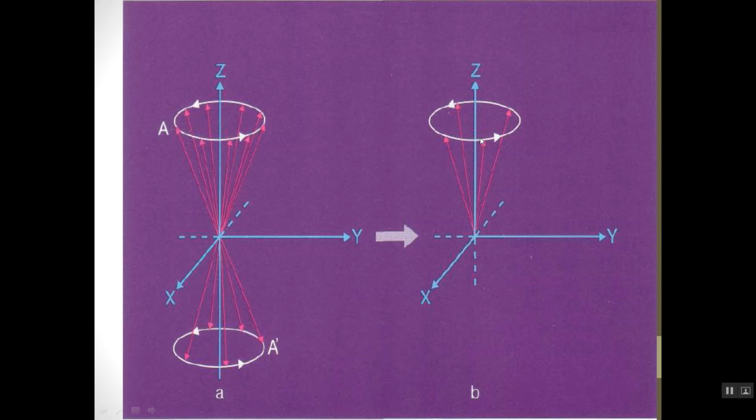How can I do this? I have to give the protons some energy to be in the excited state. Now the protons are in the relaxation state with the main field. If I give a radio frequency pulse, this pulse causes the protons to be excited in another direction, like the XY direction. After that, if I detect the signal coming out from the protons in the XY direction, the signal will come only from the protons themselves.